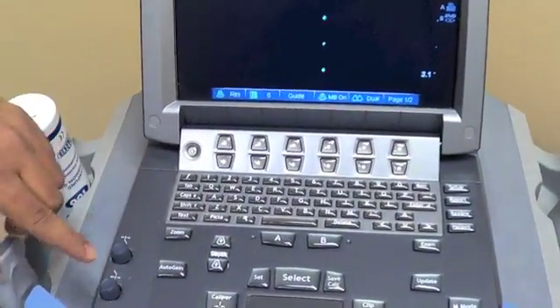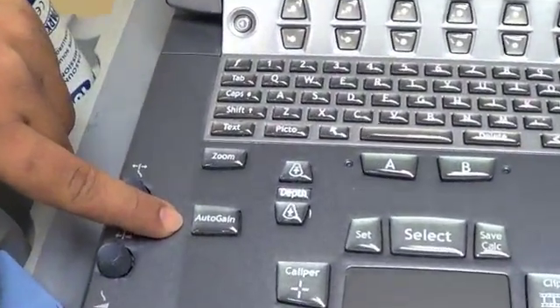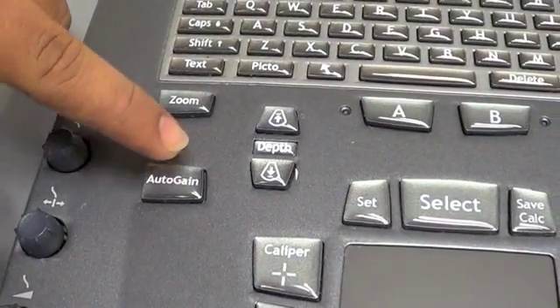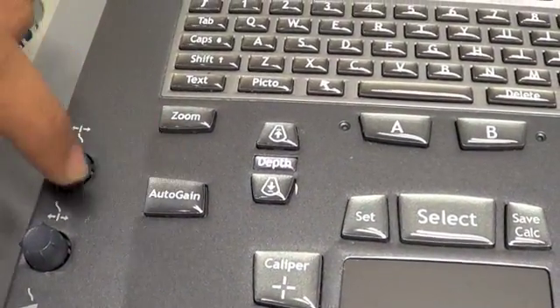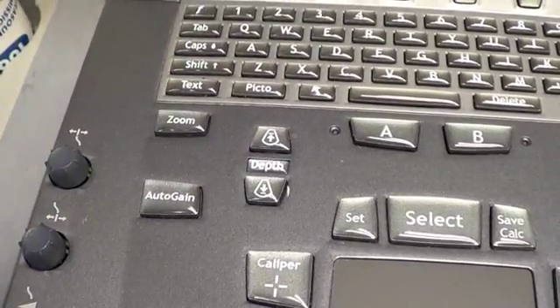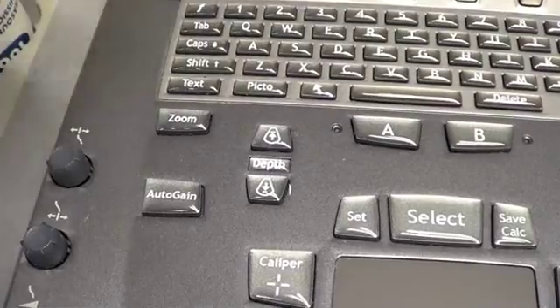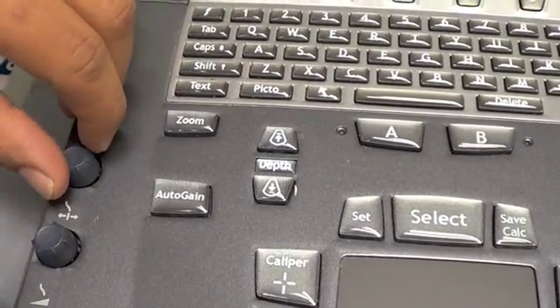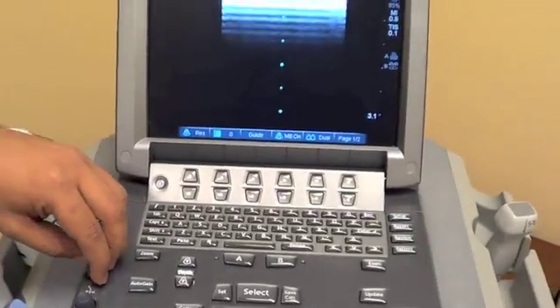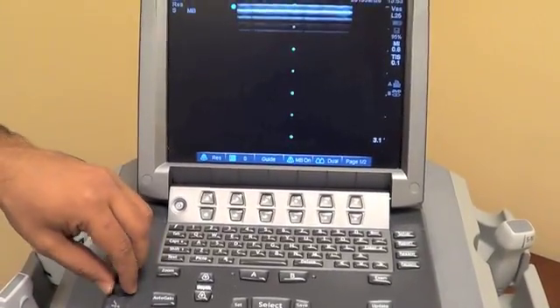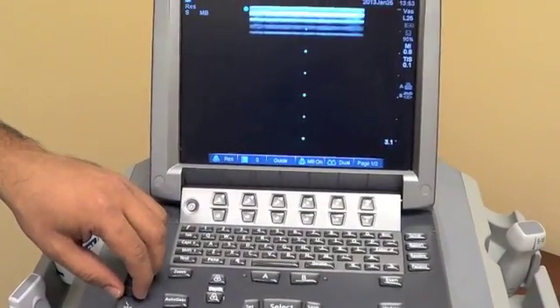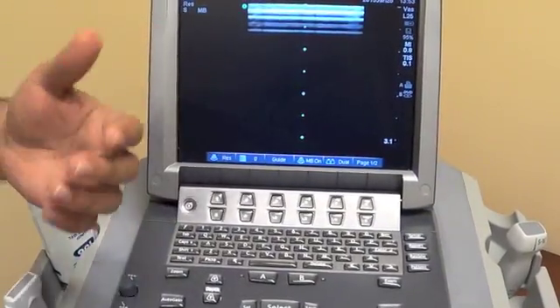The second button that's really important is called the gain button. Every machine is a little bit different, but in this machine and most machines, there's an auto gain — if you press it, it will automatically do a mathematical formulation and find the best setting. Or you can turn the knobs to increase the gain to make it really bright, or decrease the gain to make it really dark. Once you do a few of these images, you'll notice what the best setting is for different views of the body.